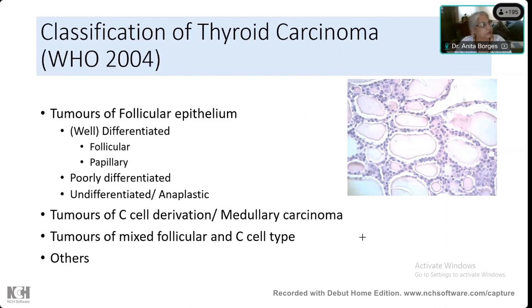What is the nature of these nuclei, which are not just round? Anything else you want to say about them? They're round, flat, with evenly distributed chromatin. Okay, they're bland. Very good. Evenly distributed chromatin is present, so it is well distributed. Actually, you can hardly see it. They're not vesicular. They are usually quite dense. They're not as dense as lymphocytes, but they can be as dense as lymphocyte nuclei. It's perfectly round. Now, anybody see a C cell over there?